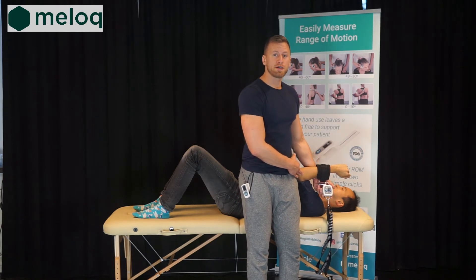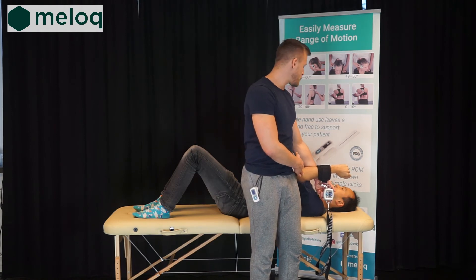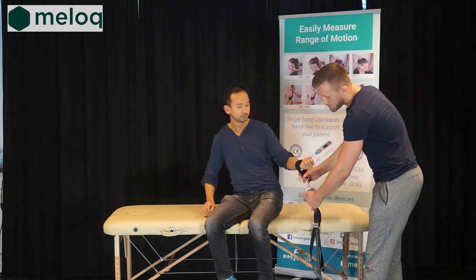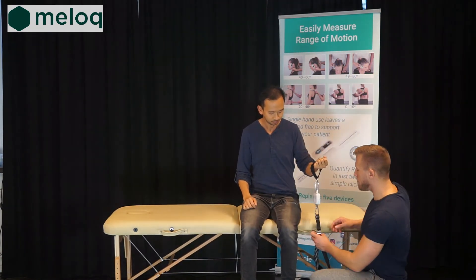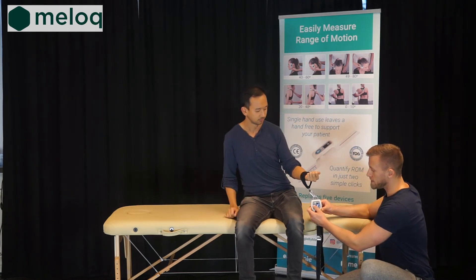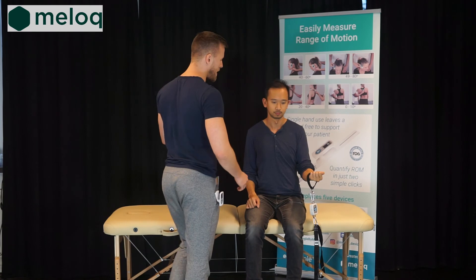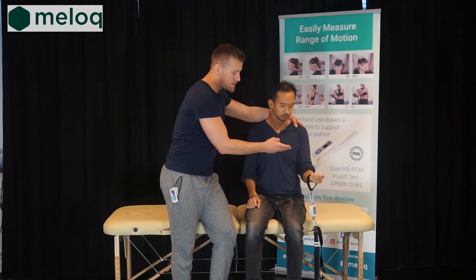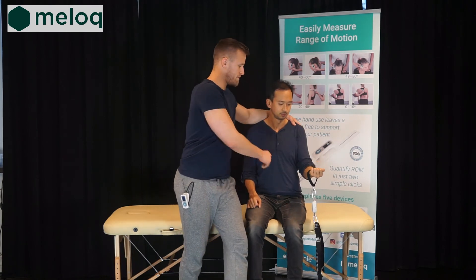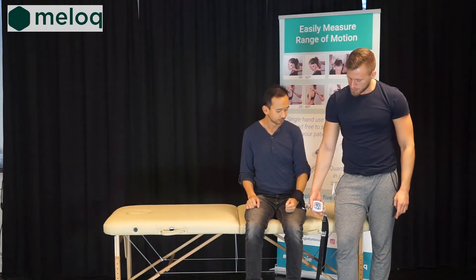Now we will proceed to measuring the muscle strength of the elbow flexion and instruct the patient to come to the sitting position. For this purpose we will slightly adjust the numbered strap to make it a little bit shorter. We start the measurement and, as previously, stand up to support the patient while he performs the movement. We have the same parameters as for the elbow extension.